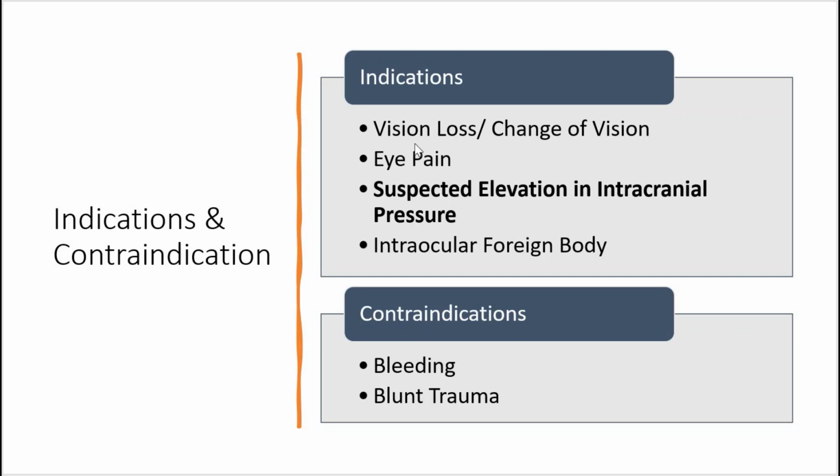You can use it if the patient is complaining of vision loss, change of vision, if they're complaining of eye pain, or suspected elevation in intracranial pressure, or if there's an intraocular foreign body. Some contraindications include if there's active bleeding and if there's blunt trauma to the eye.